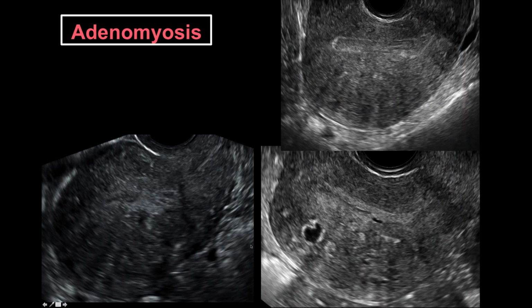These are three patients that had sonographic findings consistent with adenomyosis. So I included these examples to show you what adenomyosis looks like on ultrasound. Typically, you'll have a posterior myometrial wall that is much thicker than the anterior wall. You may have subendometrial glands, such as are seen here, and you may lose the endometrial-myometrial junction. So here, we can't tell where the endometrium ends and the myometrium begins.